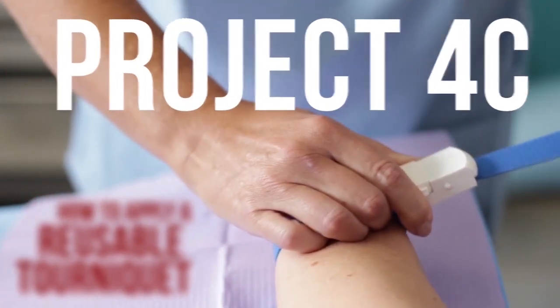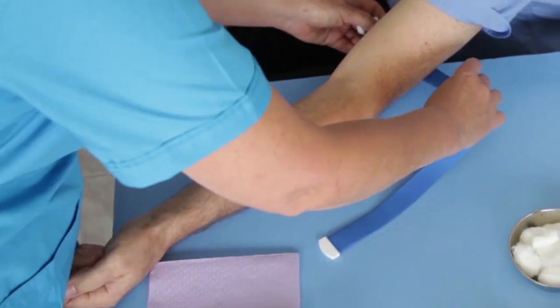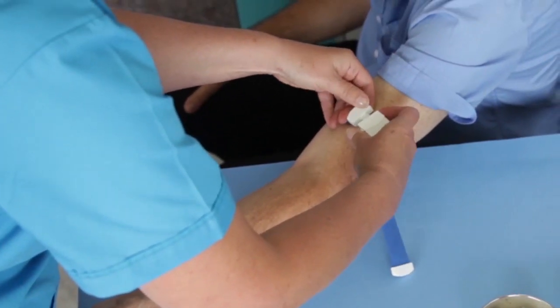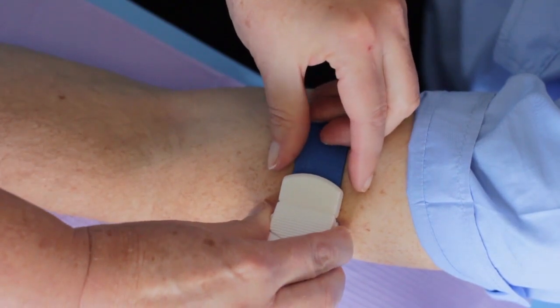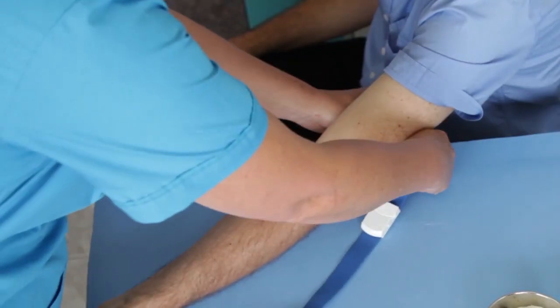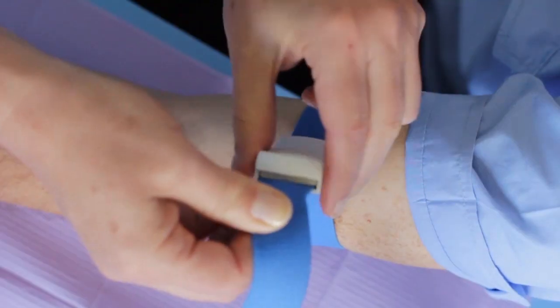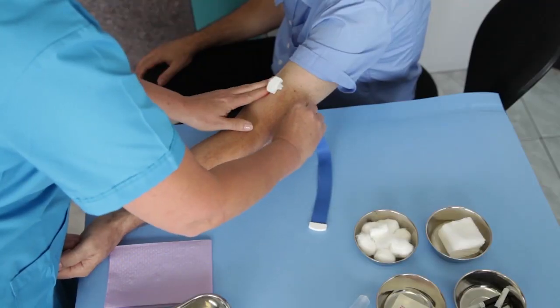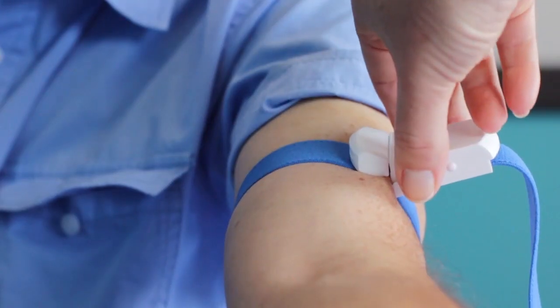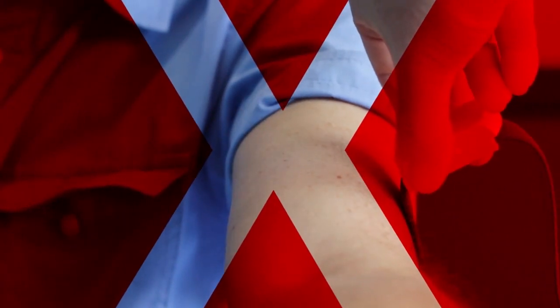Project 4C: How to Apply a Reusable Tourniquet. A good reusable tourniquet should have an easy application lock as well as a quick-release mechanism. To apply the tourniquet, simply place it around the extremity, lock it, and then tighten to a reasonable tension. To release, press the quick-release mechanism while preventing the plastic lock from flinging open, which could possibly hurt you or your patient.